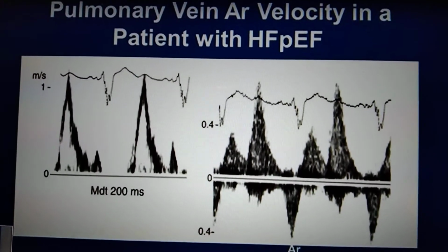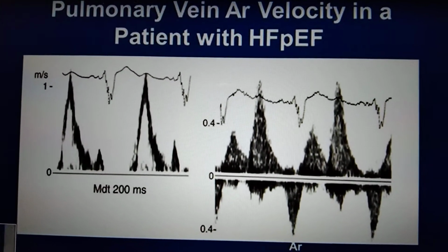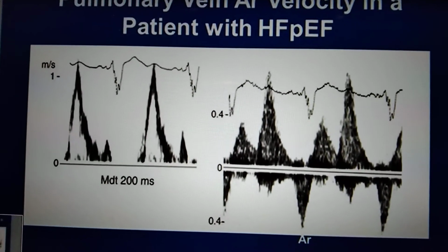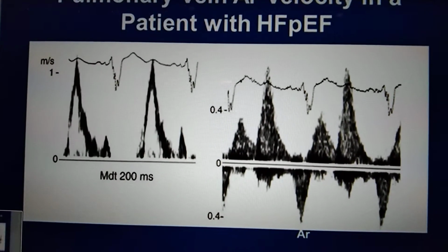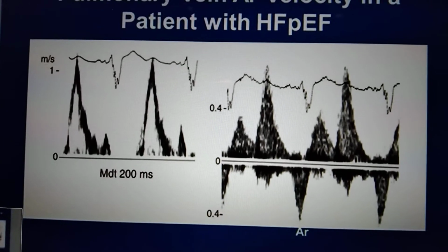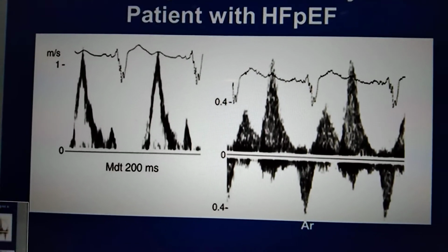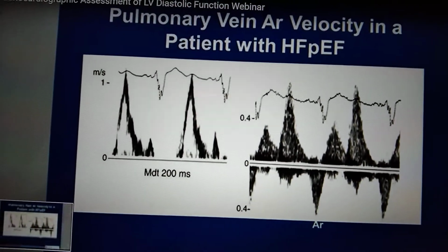When you compare it with that of forward mitral inflow, which lasts for a short time, this is happening because late diastolic LV pressures are elevated, and it is easier for the left atrium at this time to send blood into the veins than forward into the ventricle across the mitral valve. This is a very useful signal.